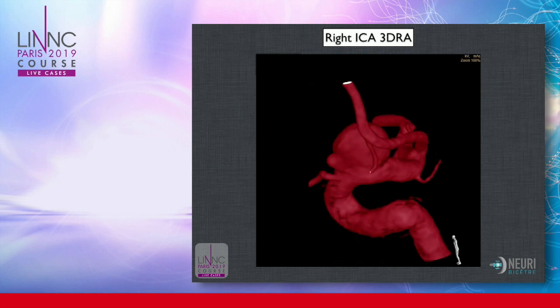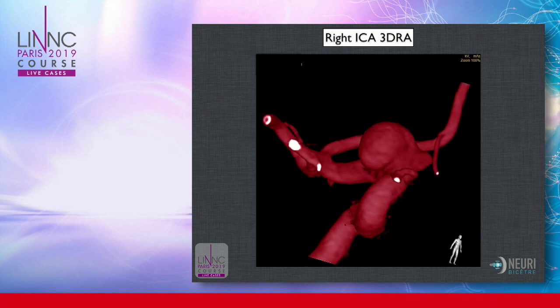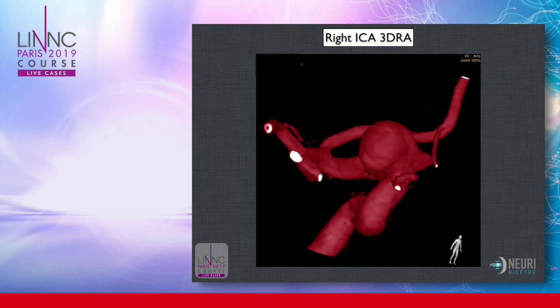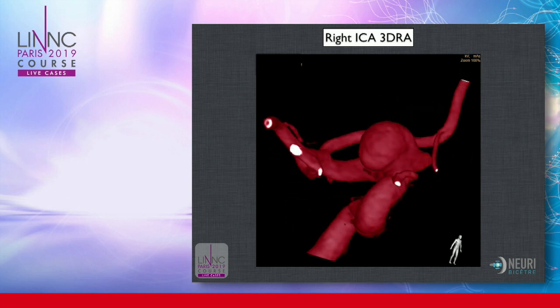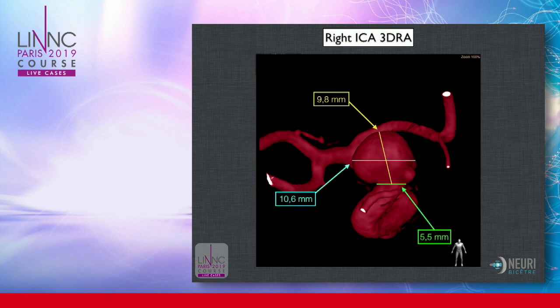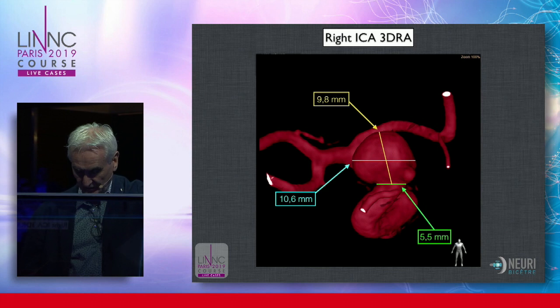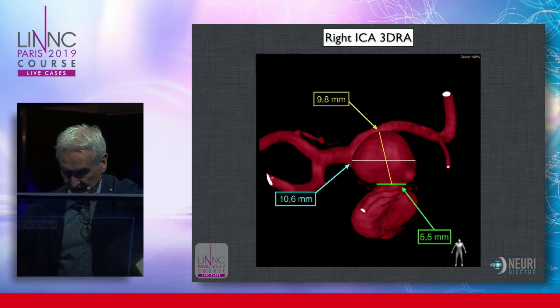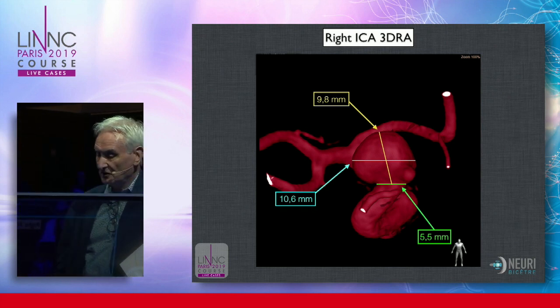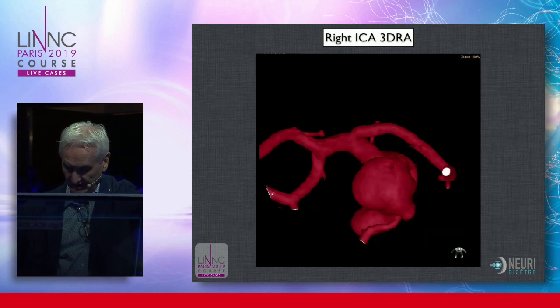You can understand the relationships with the carotid, with the ophthalmic artery, which is not included in the sac of the aneurysm, nor in the neck. There are several blebs, like here, for example, but nothing very sophisticated. So this is a measurement, size of the carotid, size of the sac, which is important and not important at the same time, because we are going to treat it with a flow diverter without any coils in the sac, but nevertheless, it's part of the screening of the aneurysm.